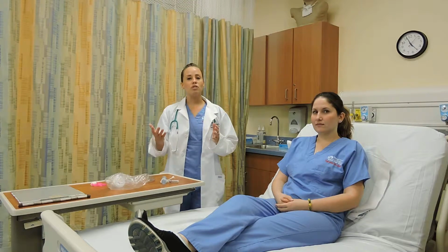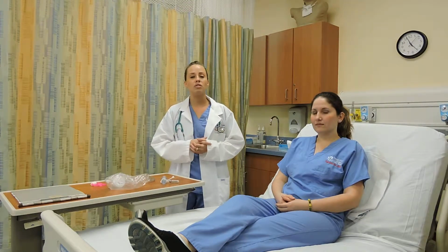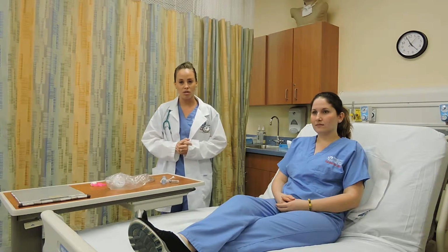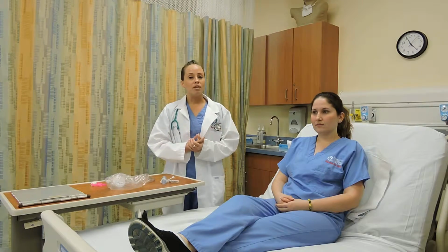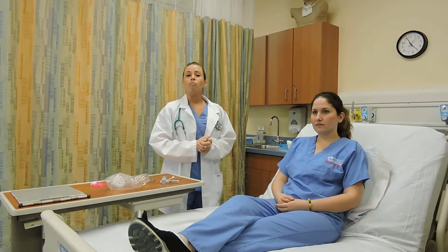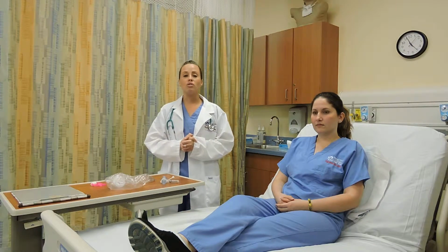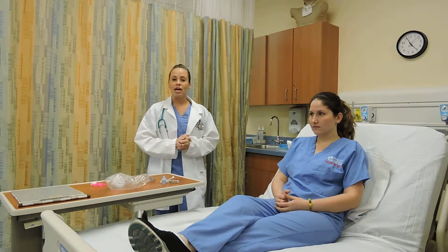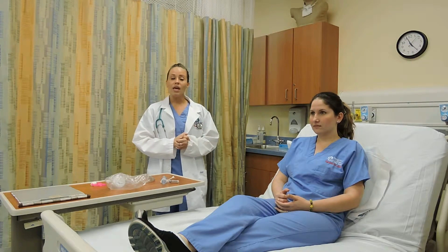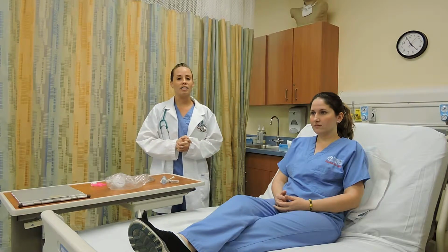Before I get into the procedure, let me address some important details such as indications, contraindications, and possible hazards and complications. Indications for EzPap is to reduce air trapping in patients with asthma and COPD, to help mobilize retained secretions in patients with cystic fibrosis and chronic bronchitis, to prevent or reverse atelectasis, and to optimize the delivery of bronchodilators in patients receiving bronchial hygiene therapy.